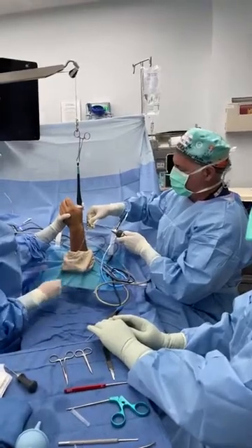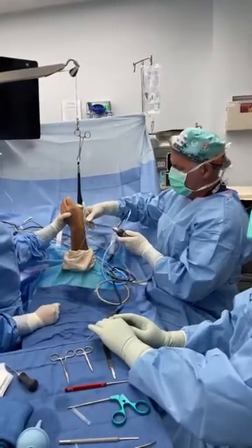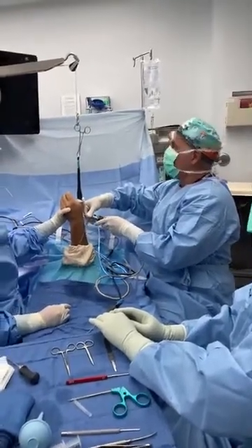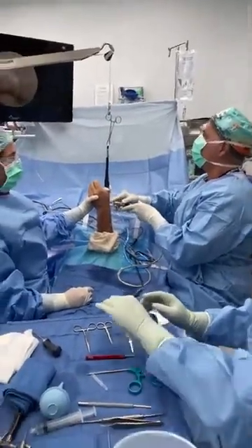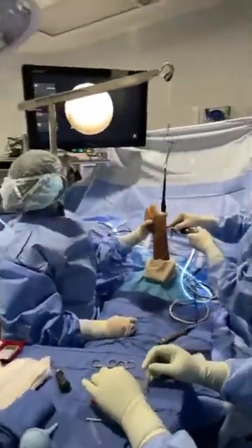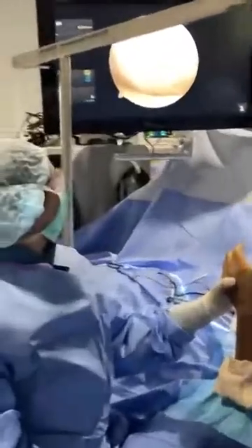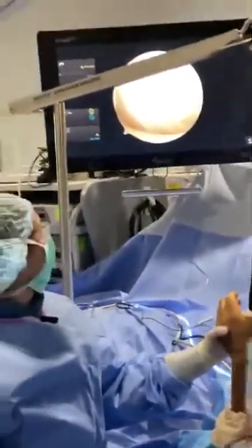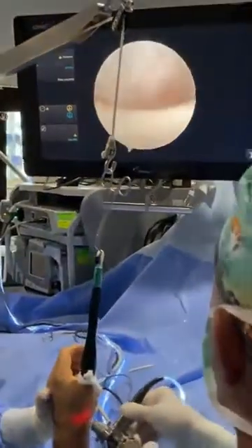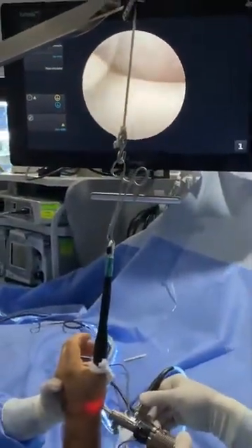So once conservative treatments fail, I'm going to put the camera in and we will see what we have. Right away I can see this is synovitis — all that inflammation there. See, there's no arthritis here. Look at the joints — look how pretty that looks.